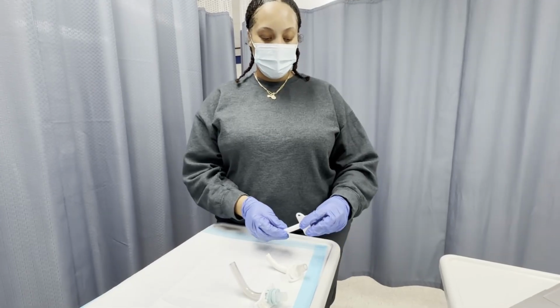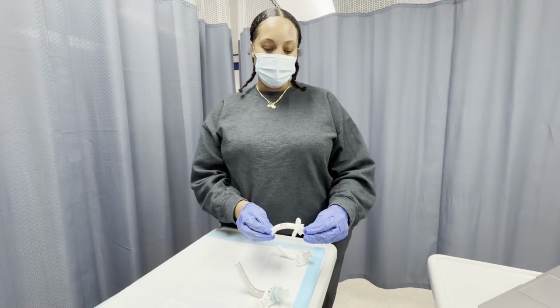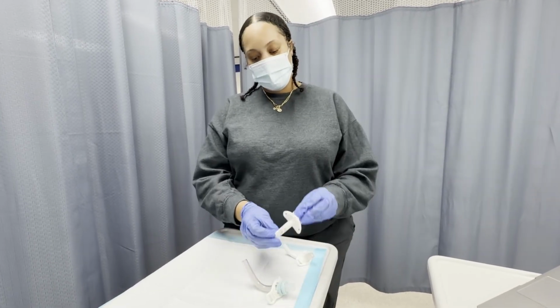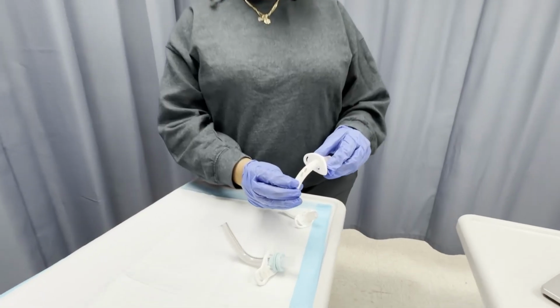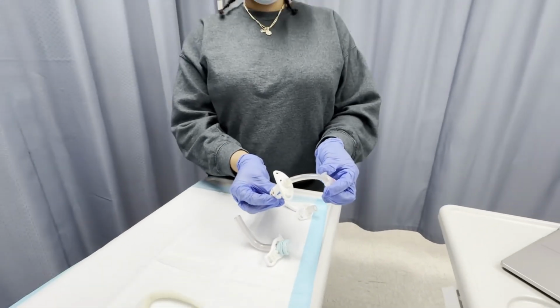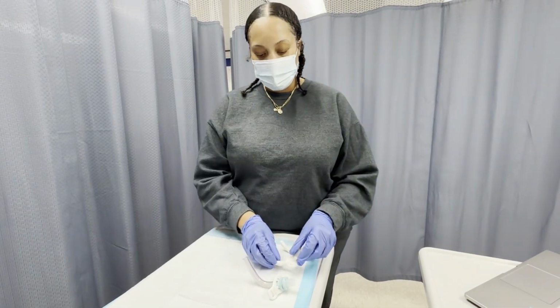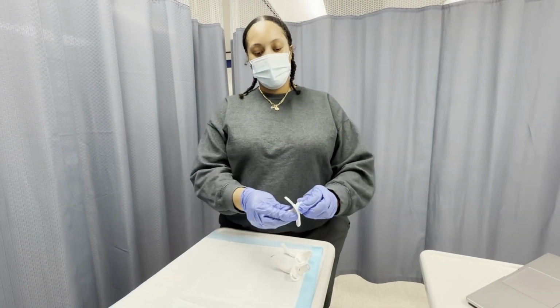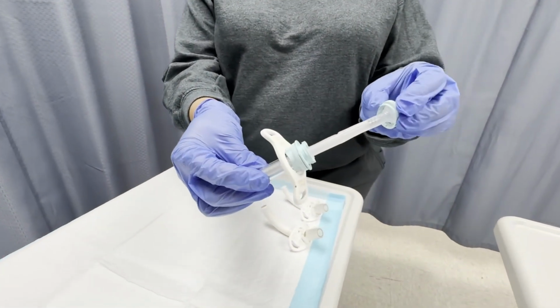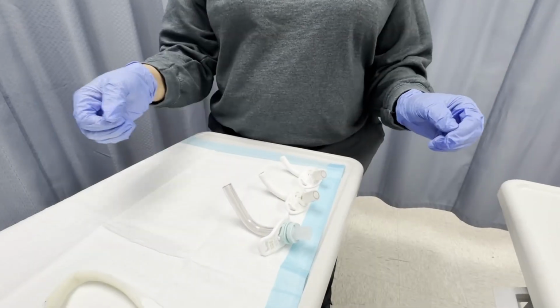Hi everyone, my name is Ashley, and today I will be telling you about the Shiley tracheostomy tubes, which are available in cuffed or uncuffed, fenestrated or unfenestrated, and in standard or extra long lengths. Most commonly used for patients requiring mechanical ventilation. Some have disposable inner cannulas for short-term use. And one key to always remember is that all inner cannulas must be in place to allow ventilation.